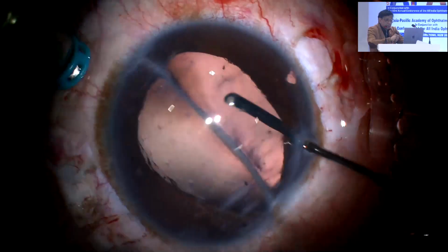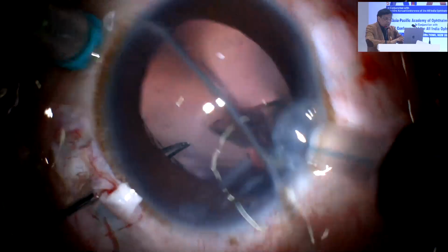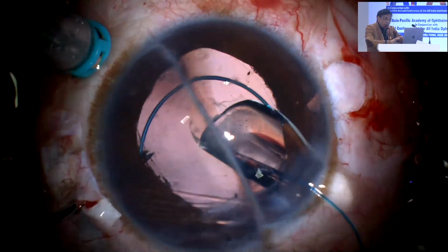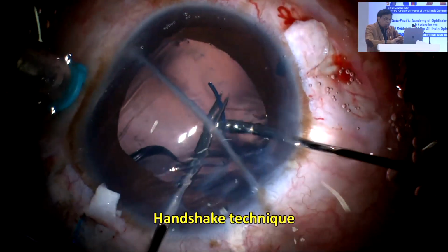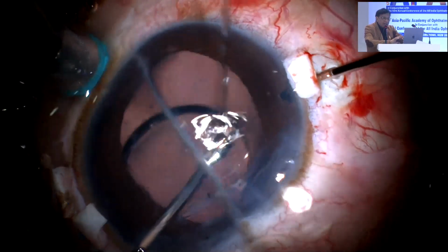I make my main port, apply my vitrectomy probe there, and once that's done, see the haptic coming out. Once the haptic is caught, wait for it to unfold, pull it out. Now look at the handshake technique going inside, transfer the haptic from one hand to the other, bring it out, and you can see the second haptic coming out.